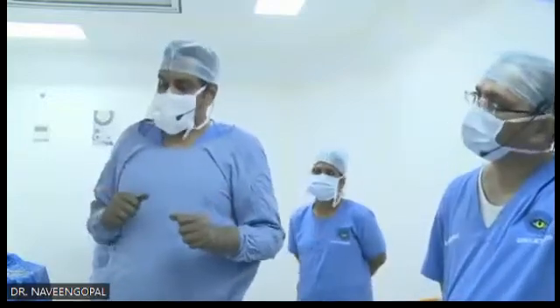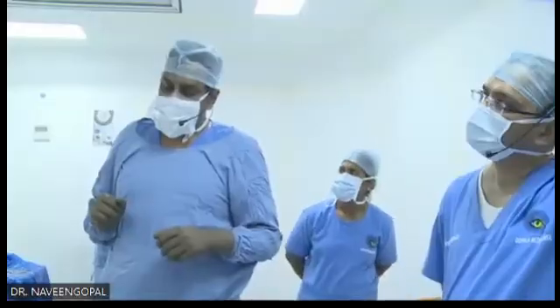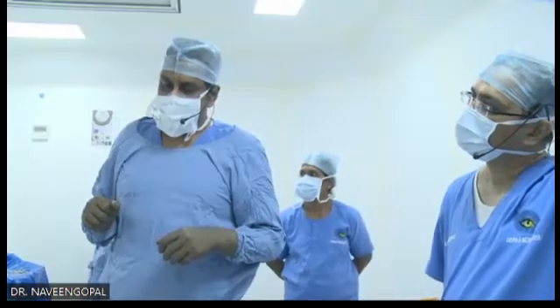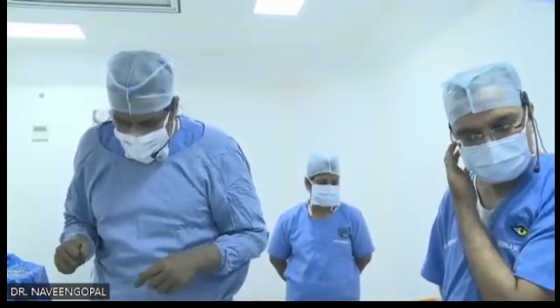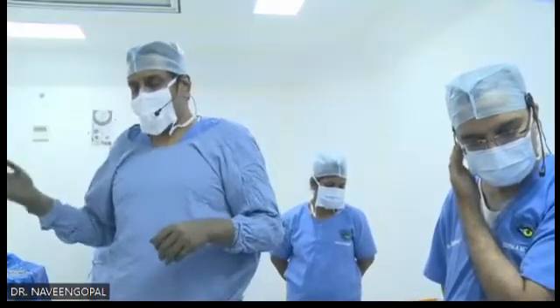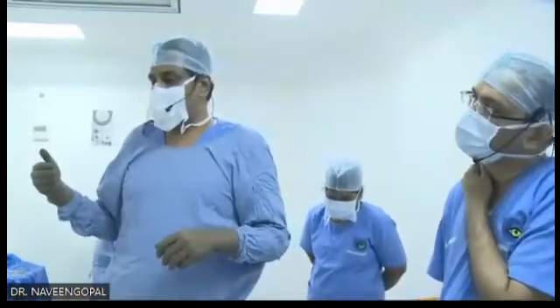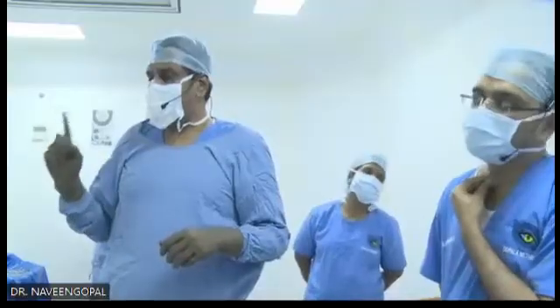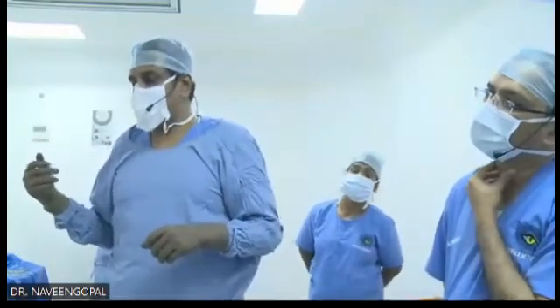And what if you hit the lens capsule? Even a small hit, not fully damaging it. How do you know it then and there? Because only after some time post-op, maybe you can see the cataract. No, immediately cataract will not come. It'll take about a week or two. It will start with anterior subcapsular cataract. I have had one cataract till now wherein I had to explant the ICL and do the cataract surgery.